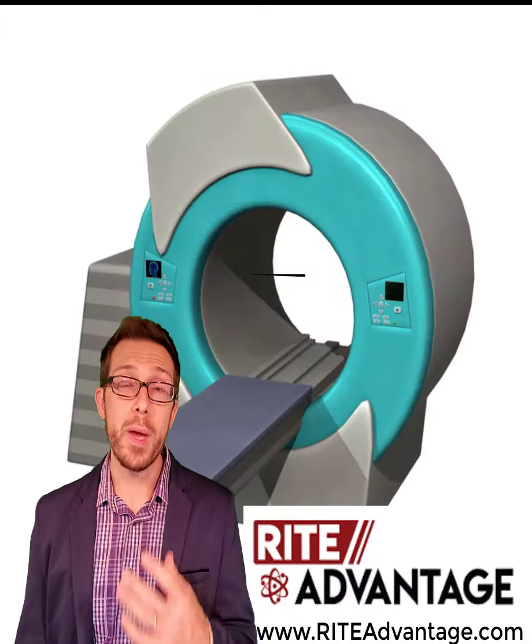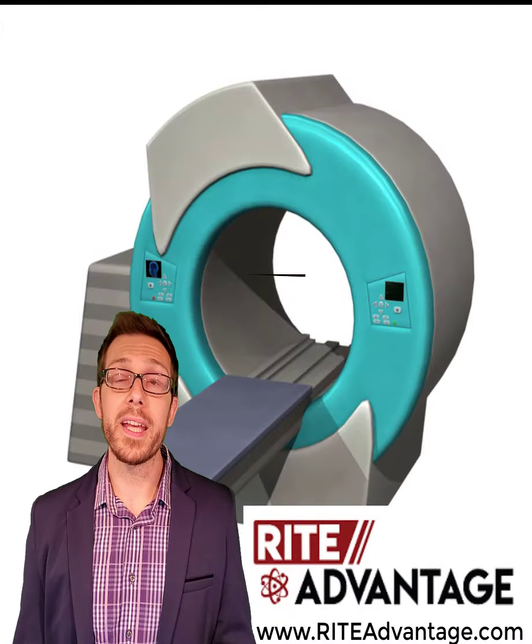A protium is the most abundant form of hydrogen out there, and it's considered an isotope. Hydrogen is derived from the Greek word maker of water, and it's very fitting considering we as humans are made up of about 70% water. Its inherent energy is based on its environment in an external magnetic field. Hydrogen in the form of a protium is what we target in MRI.